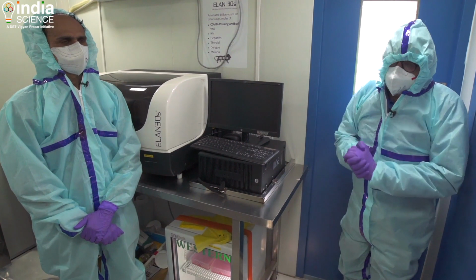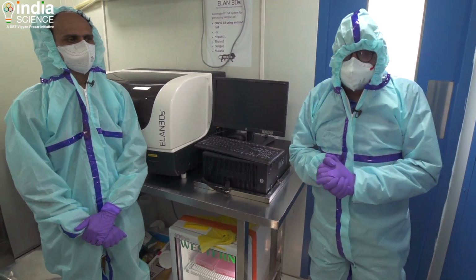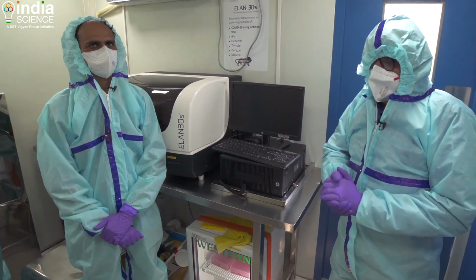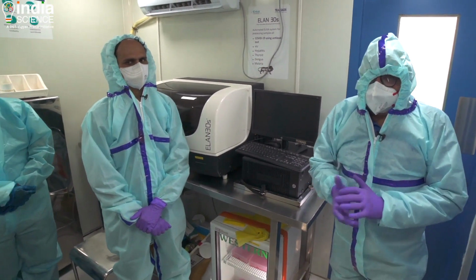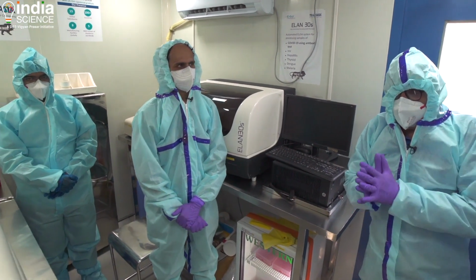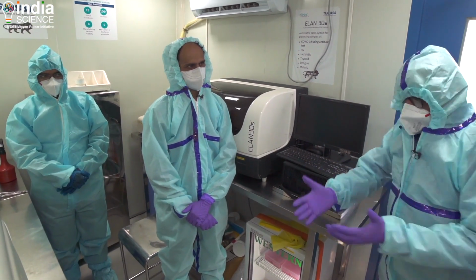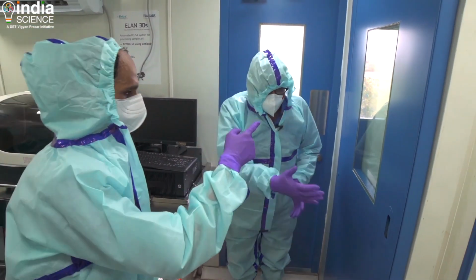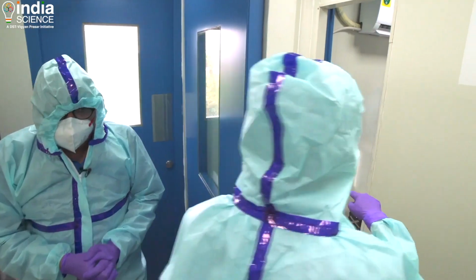Now we are inside India's infectious disease mobile lab. You can see a tiny place, but it is well equipped. And Dr. Guruprasad will show us how they do actual COVID testing. Sir, please show us. Yes, so when the samples are collected outside, the samples are brought inside in this room.